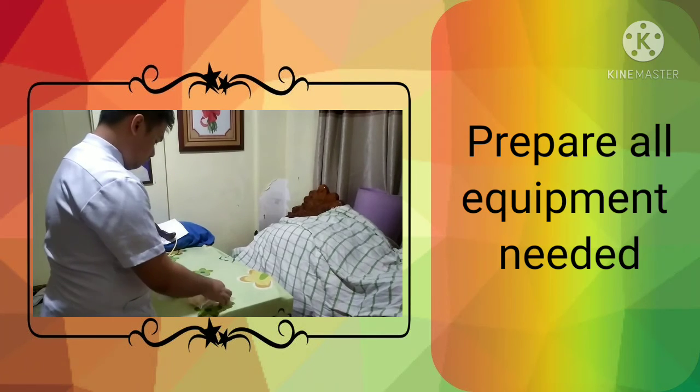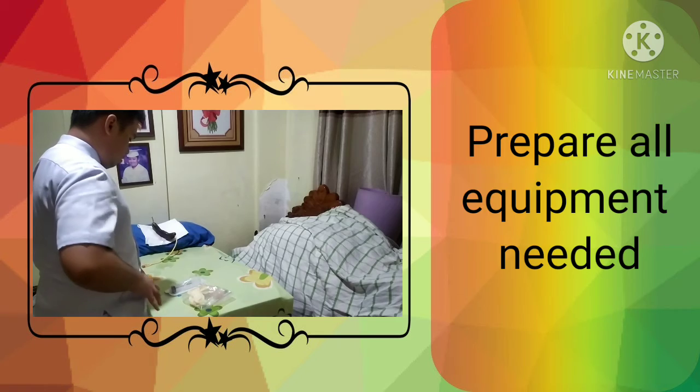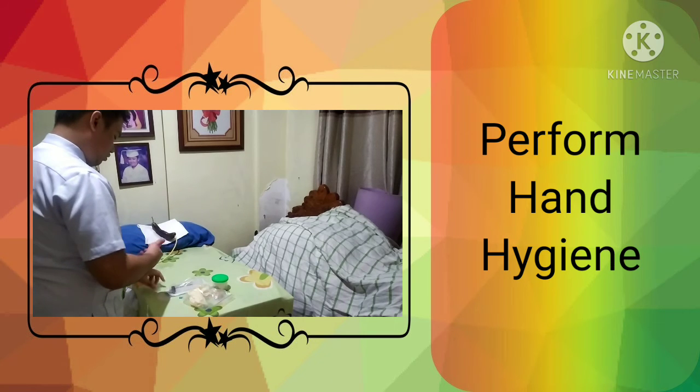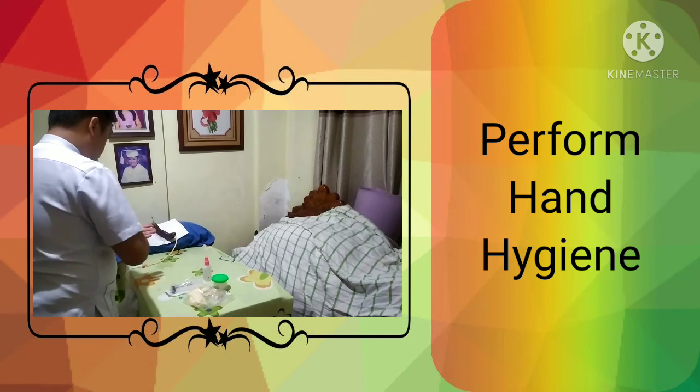Prepare all equipment needed. Next is to perform hand hygiene.